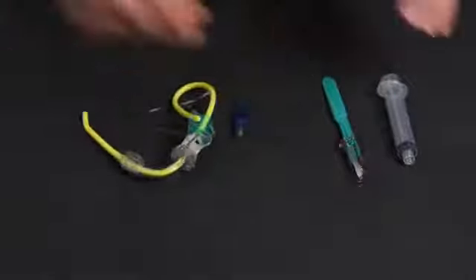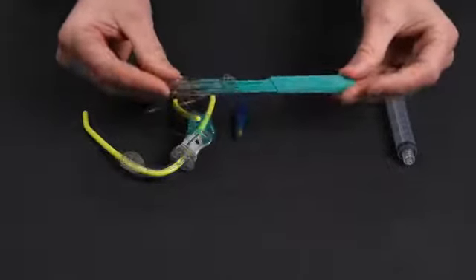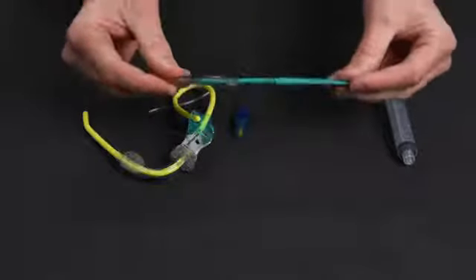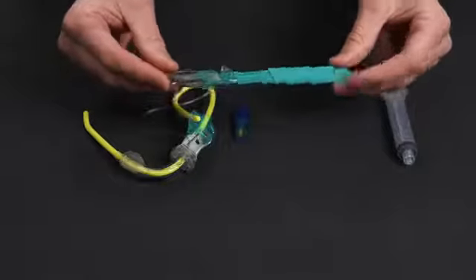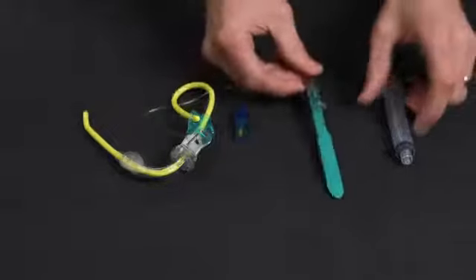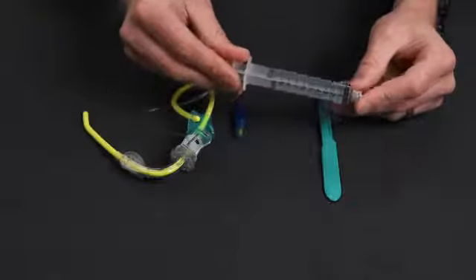So this is what I keep stocked in my kit, and it's actually very similar to the Cric Key in that regard. You'll need a scalpel. There is some debate on what size scalpel you should use. I use a number 10 scalpel for this. It's what I've been trained on and what I routinely use. And then lastly, you need a 10 ml syringe to perform it.